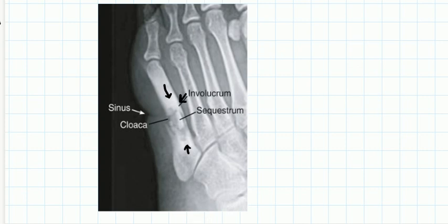This increased density — the new bone formation all around — is what you call the involucrum. You can also see a breach in the bone here; this is what you call the cloaca, through which the granulation tissue will move out. Looking at the soft tissue shadow, you can see there is a breach in the soft tissue as well — this is a sinus opening on the skin.